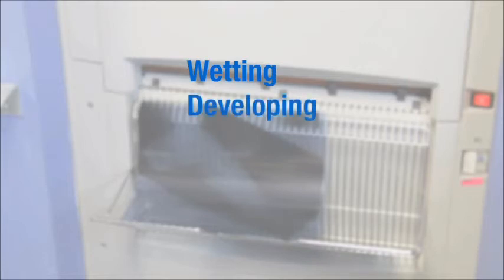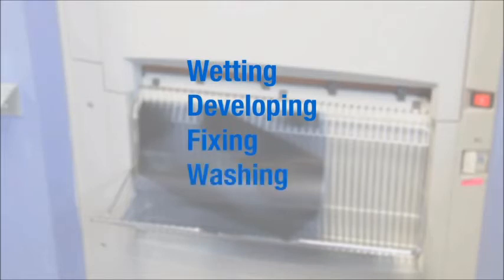Wetting: water is applied to the emulsion, causing it to expand, and allowing for increased chemical spread and permeation of the gelatin. In automatic processing, this step occurs at the same time as developing. The steps are developing, fixing, washing, and drying.